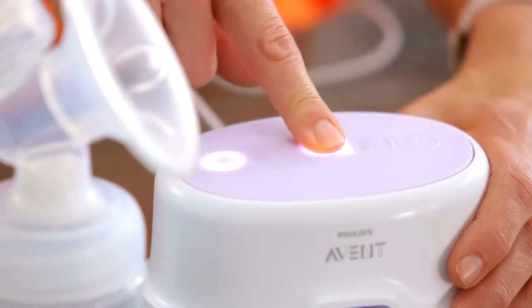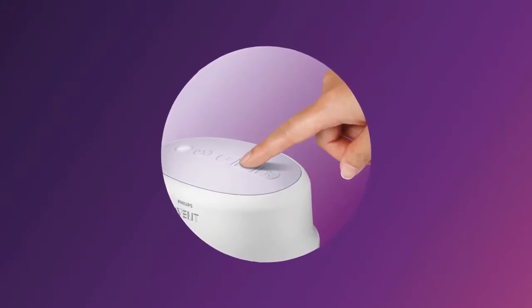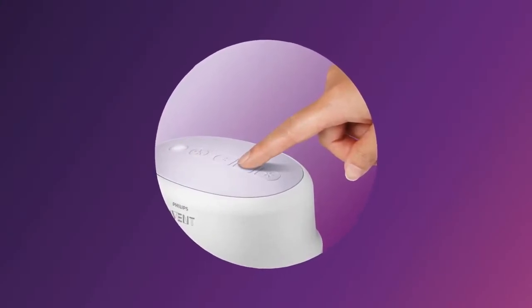Once the milk starts flowing, you can adopt a slower rhythm by pressing the lowest suction buttons. Depending on your own personal comfort, you may wish to use a higher suction mode that gives deeper suction. And then you can return to the lower suction mode at any time throughout the feed.